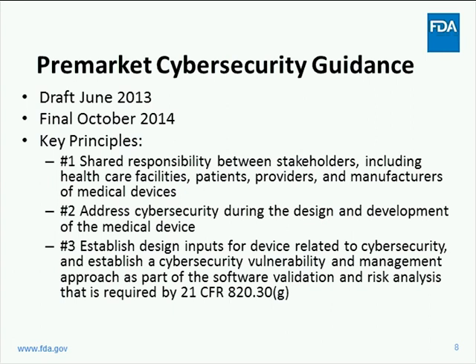Our approach to medical device cybersecurity, as I mentioned earlier, is a total product lifecycle approach, from the earliest of design and development stages out to obsolescence. Therefore, in June 2013, we issued pre-market guidance in draft, finalized in 2014. The key principles: number one, shared responsibility between stakeholders. Number two, address cybersecurity during the design and development of the medical device. And third, the importance of establishing design inputs for the device related to cybersecurity.